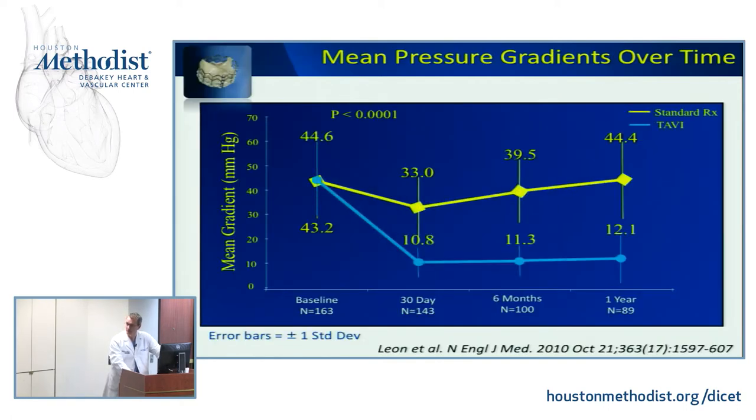All right, and again, this is what I've shown you. This is just a slide of Sapien valves, TAVR. They're all about the same. The expectation of a mean gradient is around 10. So really very good. And DVIs generally over 0.5.